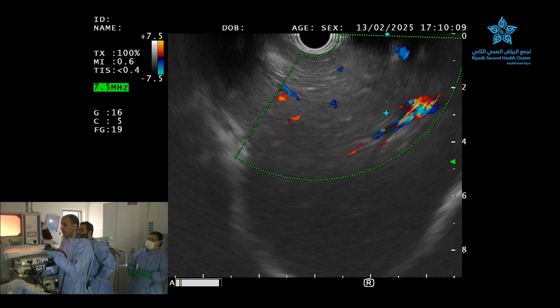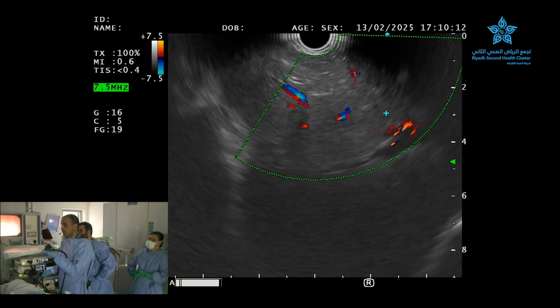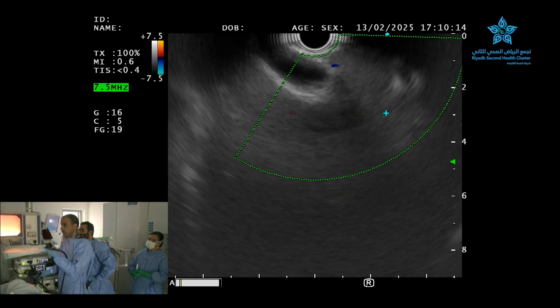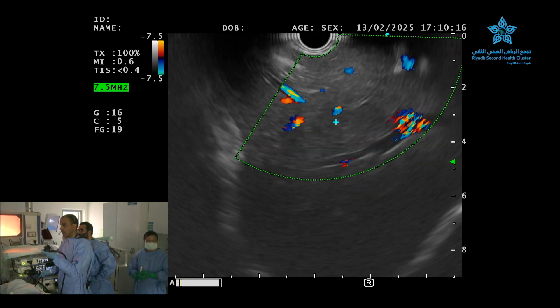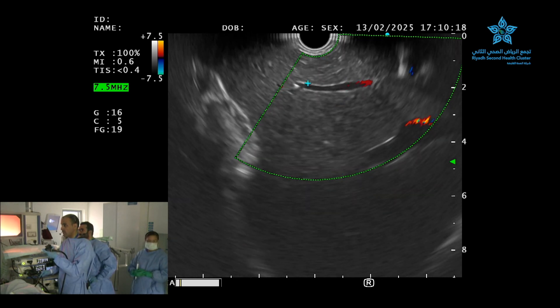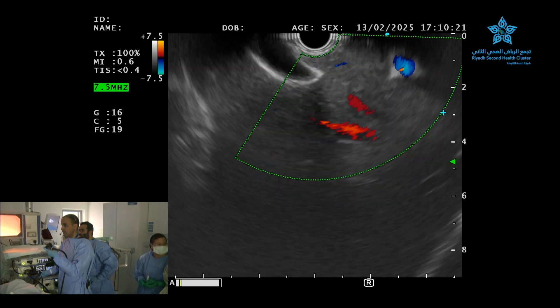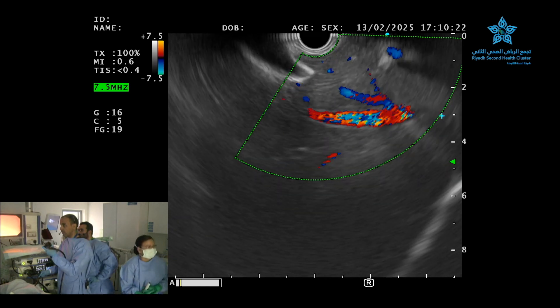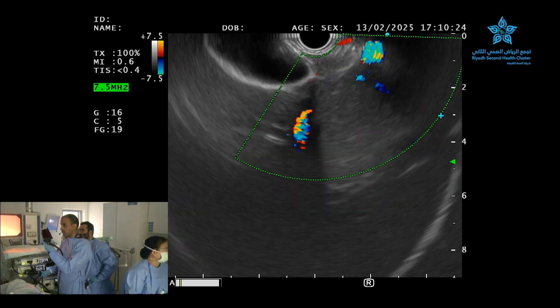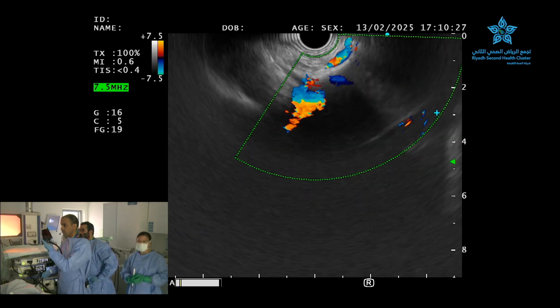Now we are examining the liver from the GE junction. We can see here a structure — if we go a little bit to the right, Nawaf, go clockwise, even more clockwise.